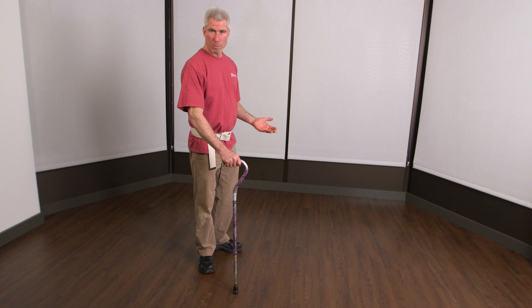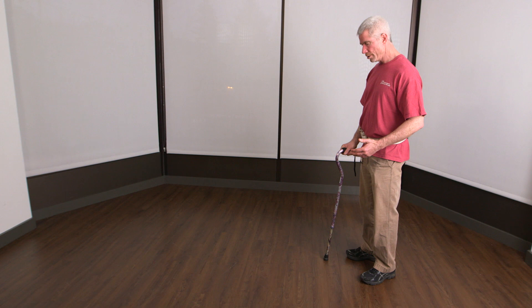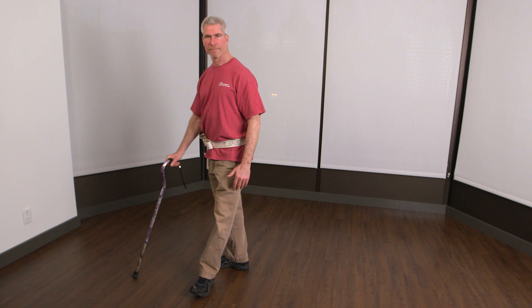There are a couple of ways to walk with it. I could put it out there and step to it — that's very stable. A little bit faster is to put it out there with the other leg. It's less stable, but it's smoother.